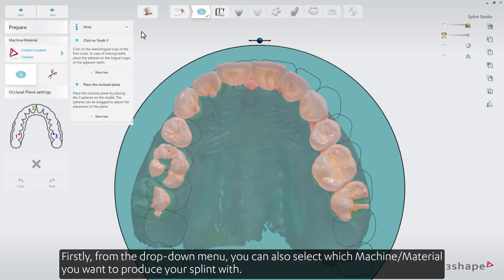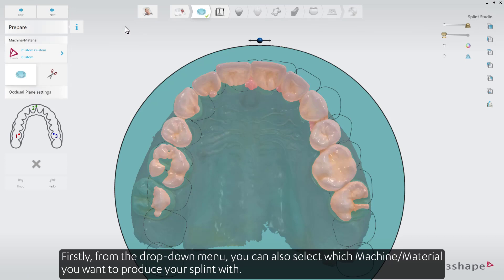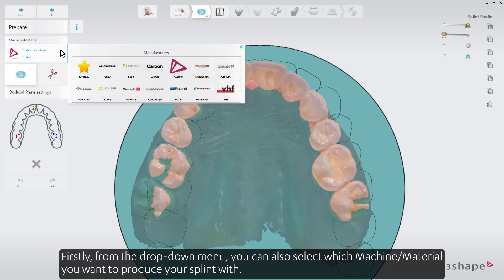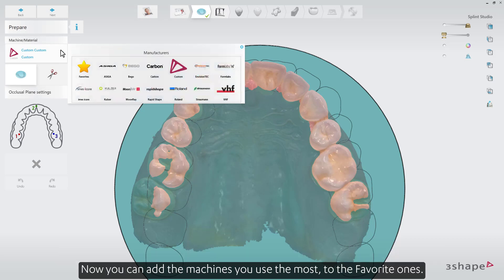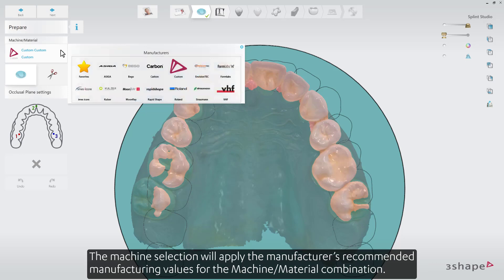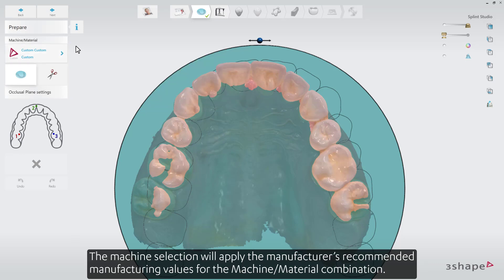From the drop-down menu, you can select which machine or material you want to produce your Splint with. You can also add the machines you use the most to the favored ones. The machine selection will apply the manufacturer's recommended manufacturing values for the machine-material combination.